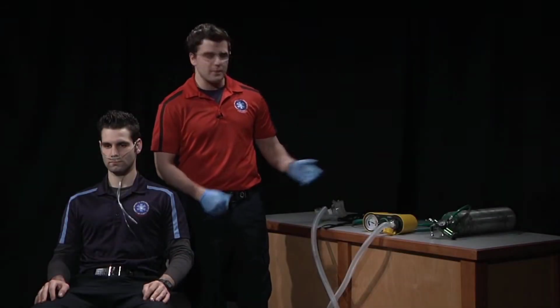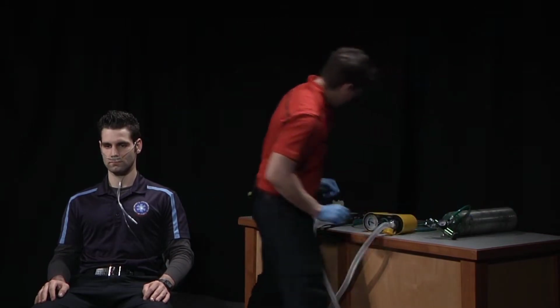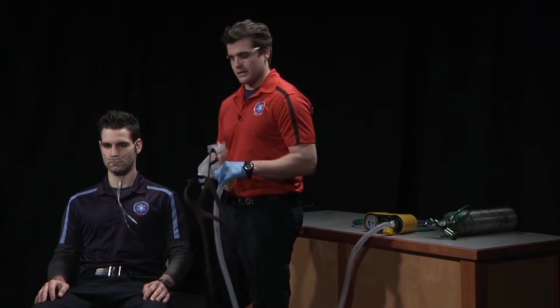After our CPAP machine has been assembled, we're going to go ahead and turn our oxygen on. From there, we're going to take our CPAP mask and place it over the nose and mouth of the patient while making sure the end-tidal CO2 nasal cannula stays in place.